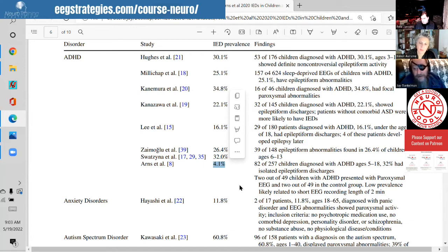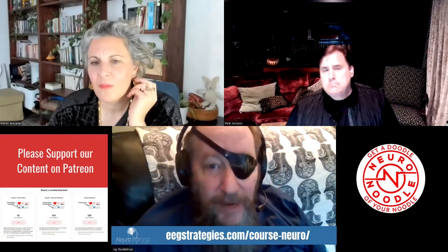I did an EEG review yesterday. It had one full-blown epileptiform discharge in a 20-minute study, eyes open, eyes closed combined. It was a dramatic discharge. In between that, there were some little hints, but there wasn't anything diagnostically significant until the discharge. So the total amount of time recorded ends up being critical as to what you can end up seeing. And I would urge people to try to meet the minimum guidelines. They're there for a reason.